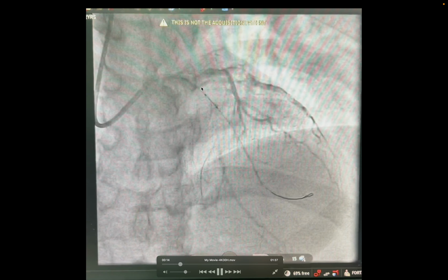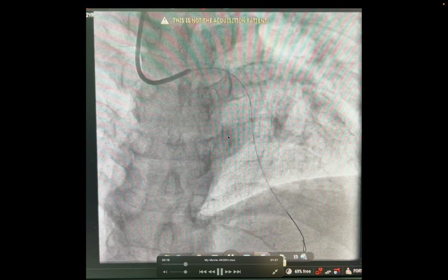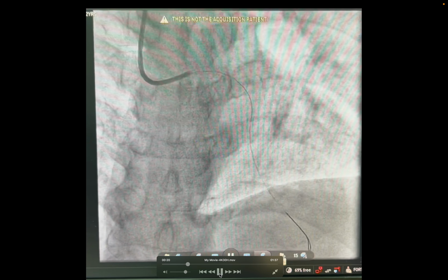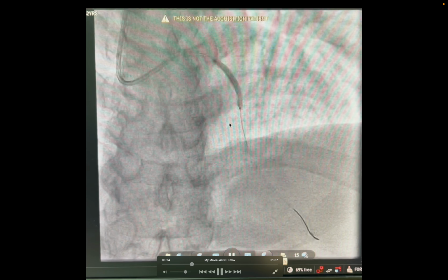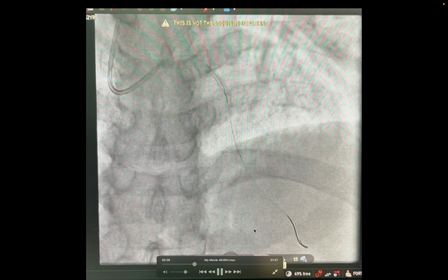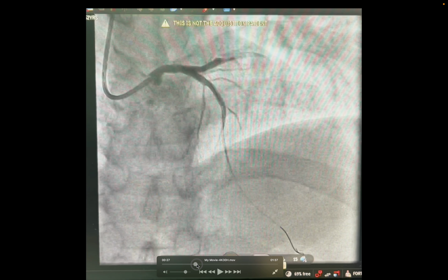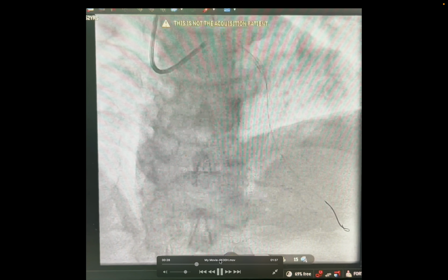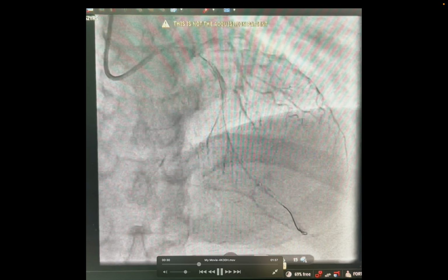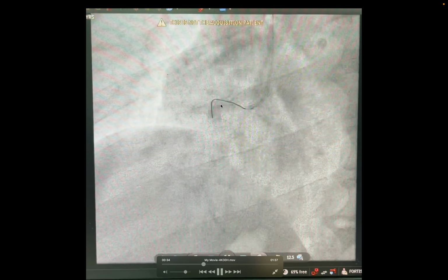So the first artery I'm going to open, I'm ballooning it, and after ballooning I have stented the vessel. So one stent has been put over here. This is the stent which I am putting, and it has opened nicely. The artery has been opened very nicely, and I was very happy. However, I still had one more blockage to go. So once this artery was managed, I went to the right side artery.